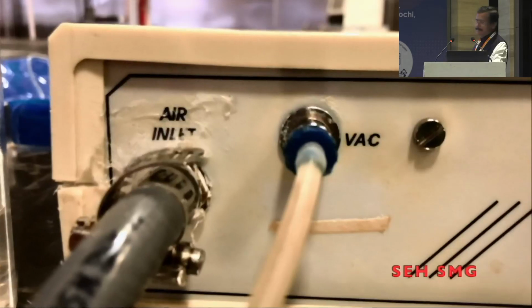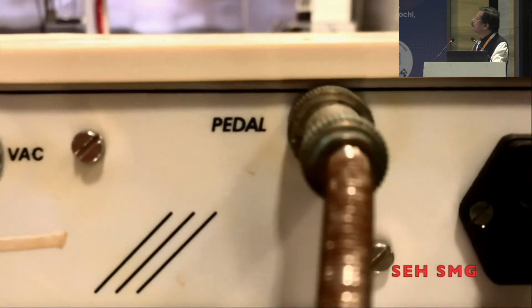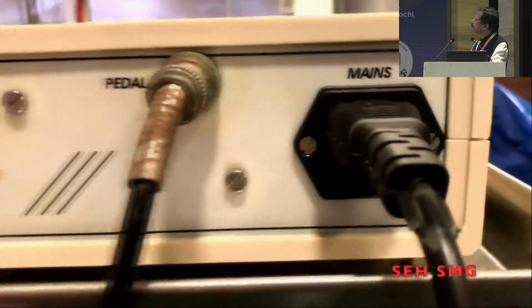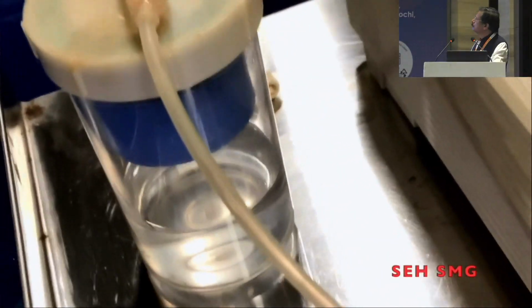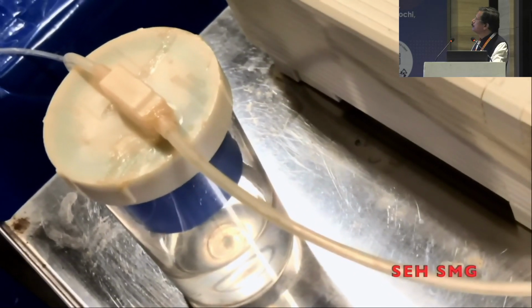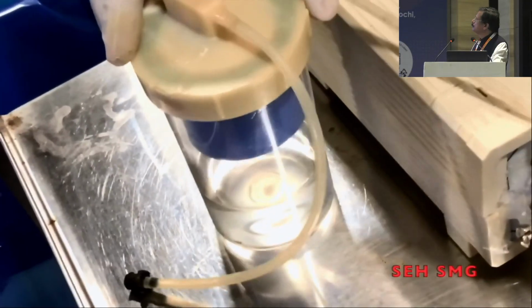This is the back side of the vitrector: air inlet, vacuum, foot pedal connection, and electrical switch wire. And the air comes from the central compressed air outlet in our hospital, and also these machines will come with small tiny compressors. This is a small bottle which helps to create vacuum by Venturi pump system.